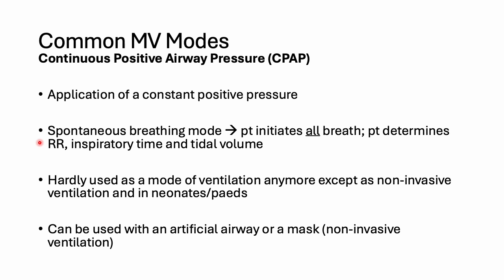Of course, CPAP may mean different things to different people, but in this context, the true meaning of CPAP is the application of a constant positive pressure, just one pressure. Spontaneous breathing mode, as mentioned in part 1, means that the patient can initiate all the breaths and stop all the breaths. They can determine their respiratory rate, how long the inhalation time is, as well as how big or small their tidal volume is.